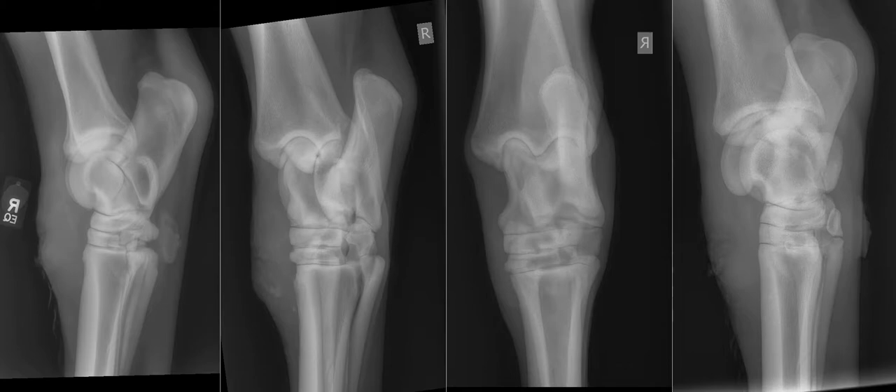The radiographs on the screen show, on the left, a lateral medial view of the right tarsus, a dorsolateral plantaromedial oblique view of the right tarsus, a dorsoplantar, and a dorsomedial plantarolateral oblique view. So we've got the standard four views you'd expect of the tarsus.